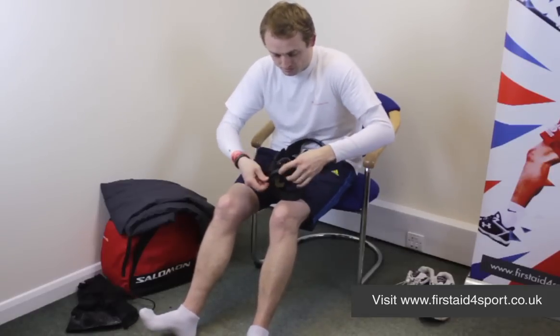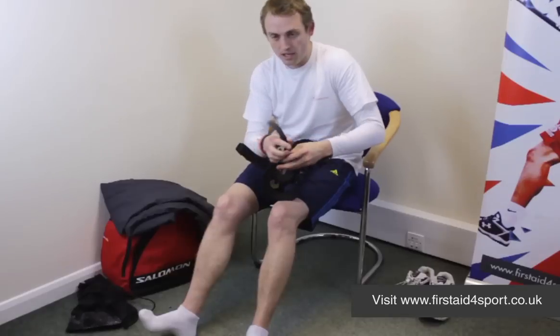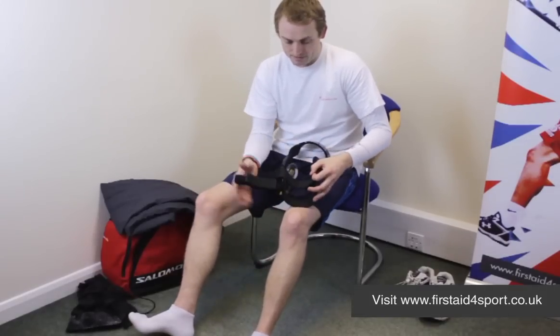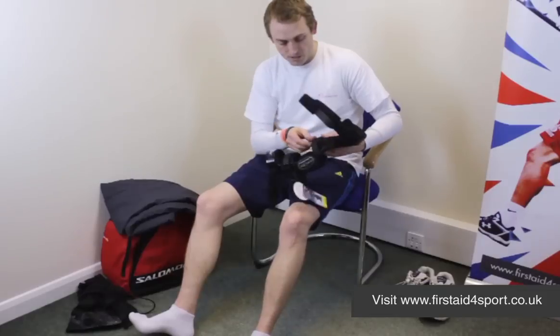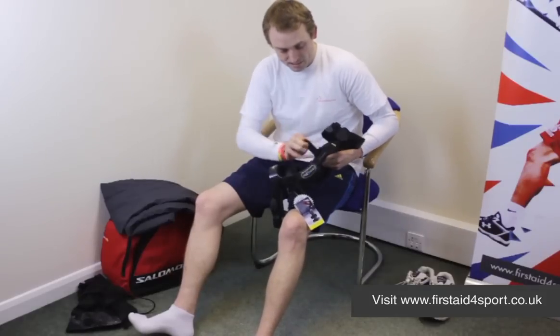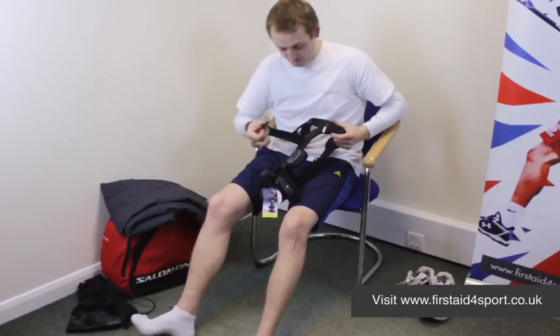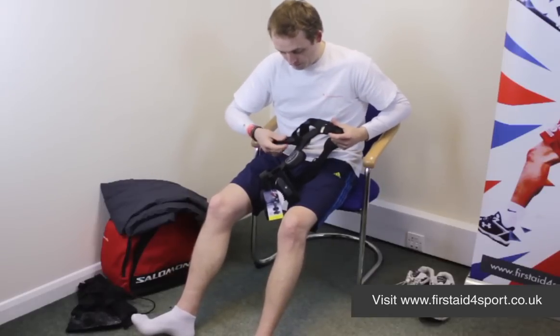To show you how to put it on, a little tip: when you're undoing all the Velcro, quickly just stick it back down again so when you're trying to put it on, they don't stick each time you move. Because if you just leave it open, it sticks to other bits, so it's much easier if you just take it off and stick that on.